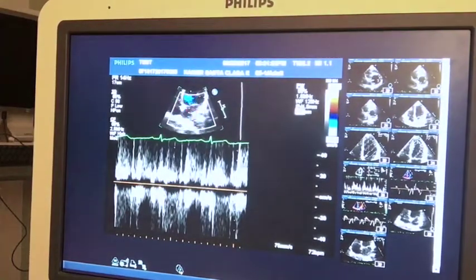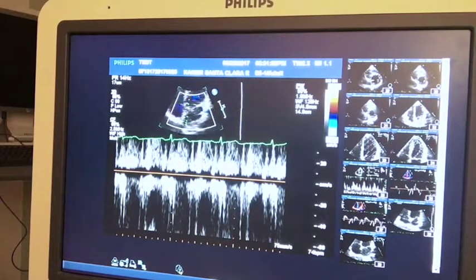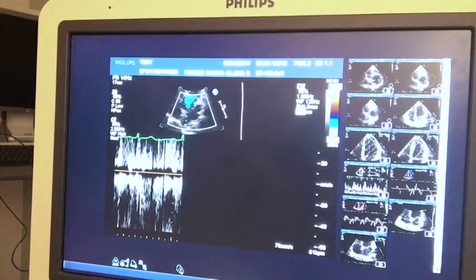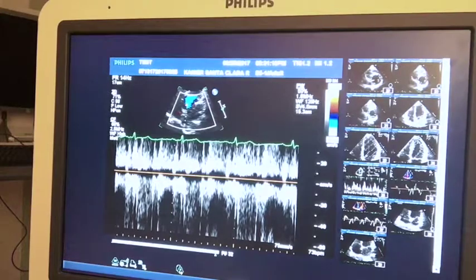If they are part of a MitraClip, they have had a significant mitral regurgitation, and then they had a device added to close that regurgitating valve. We call that a MitraClip. Then often we have to measure the pulmonary vein velocity.